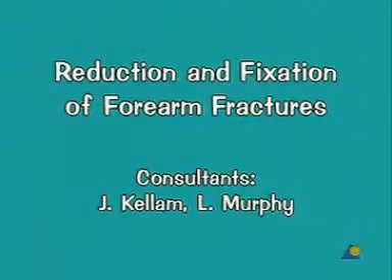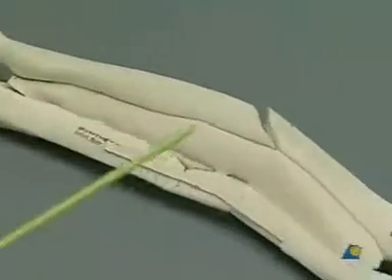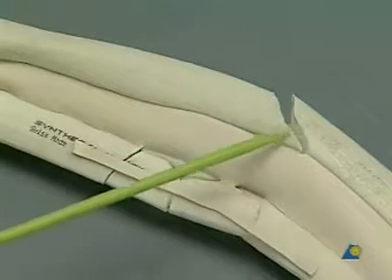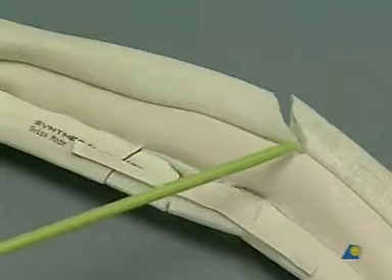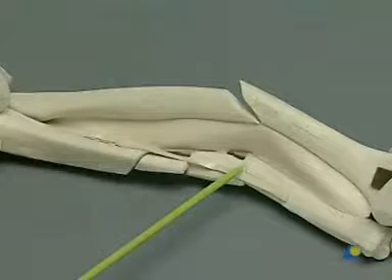Reduction and Fixation of Forearm Fractures. A short oblique fracture of the radius, just distal to the mid-shaft, combined with a mid-shaft multi-fragmented fracture of the ulna.